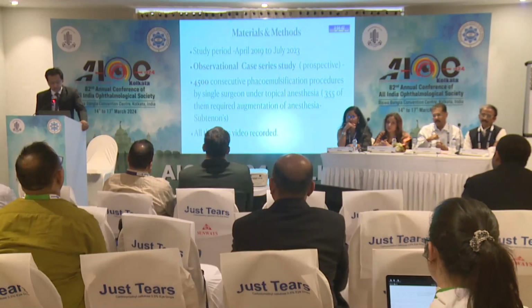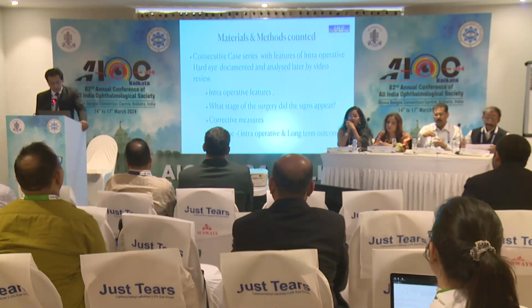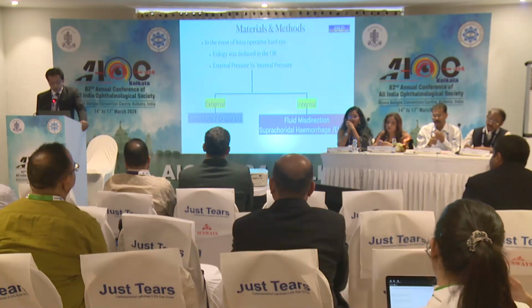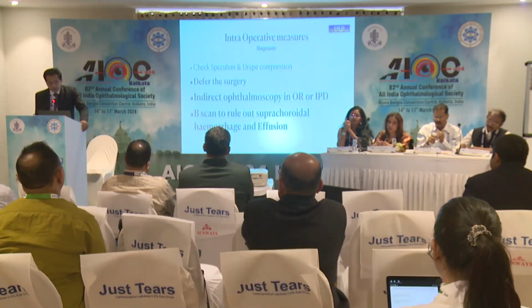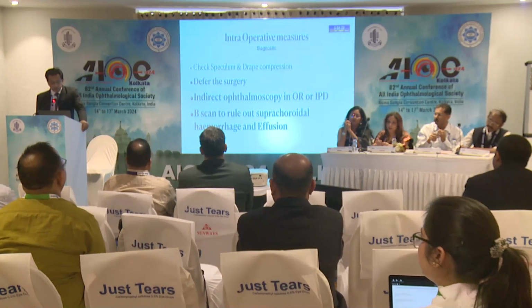It's an observational case series of 4,500 consecutive phaco procedures, and we studied the intraoperative features, what stage of the surgery the sign appeared, outcomes, and corrective measures. Etiology was deduced into two forms: internal issues like fluid misdirection or suprachoroidal hemorrhage, or external like a tight drape or speculum.